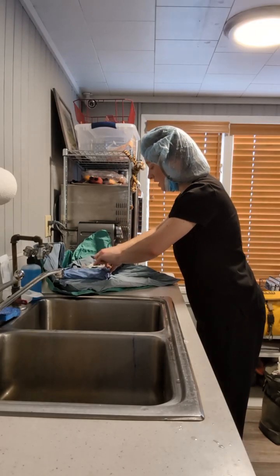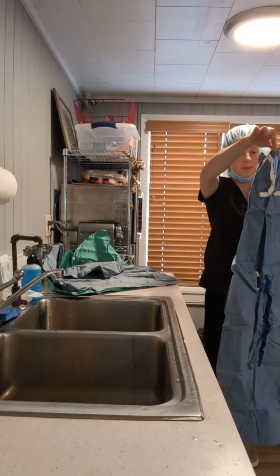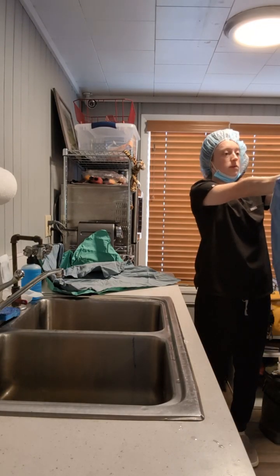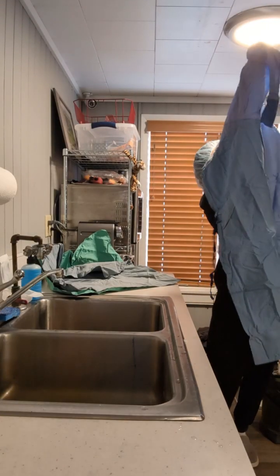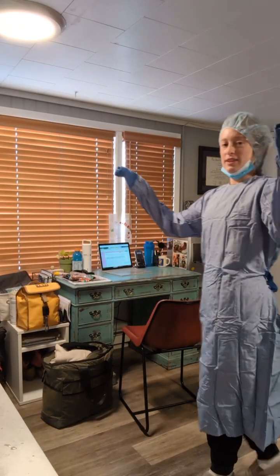So I want to lift the gown by the neck. I'm going to step away to let it unfold. And I'm going to put on the gown. Push my hands into the armholes. And I'm going to have an assistant come and tighten.